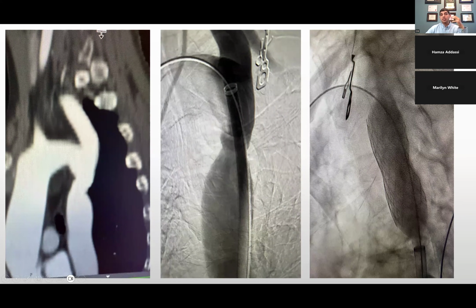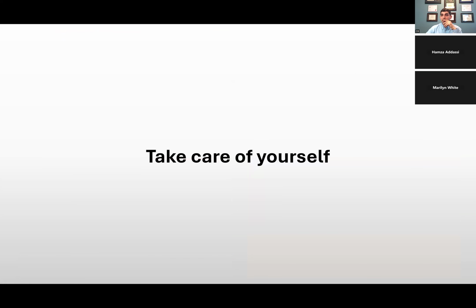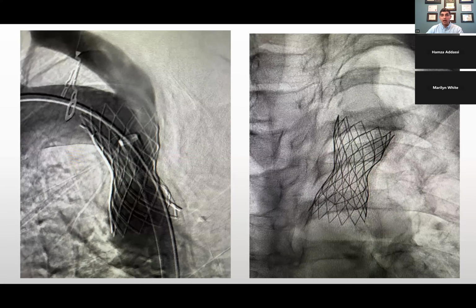And this patient has significant pulse discrepancy between her radials and her femorals, and significant symptoms. And again, thinking outside the box, she cannot tolerate surgery. So go in from the leg, travel up, put a stent and balloon it, and open it back up for her. And she feels very, very good right now. So I think that's pretty much the nutshell of what I have.